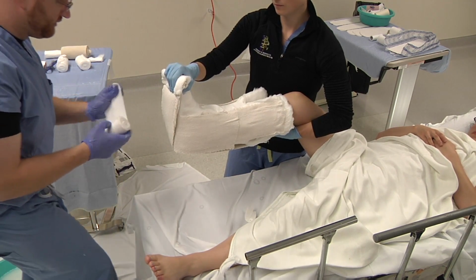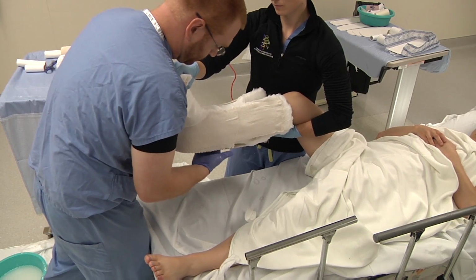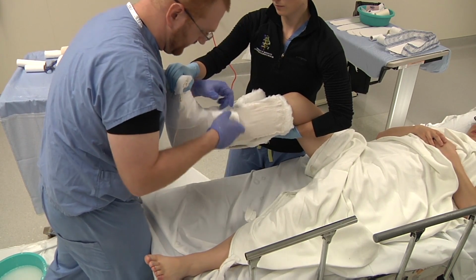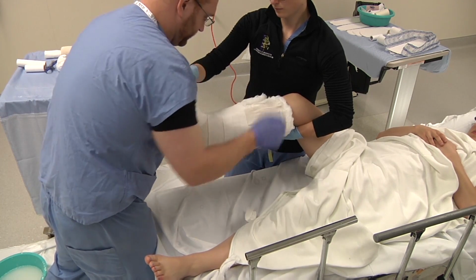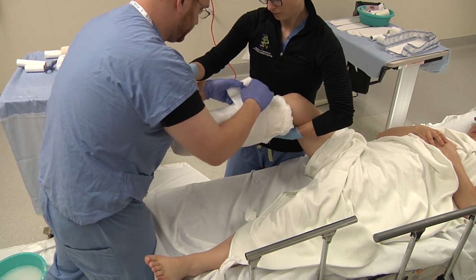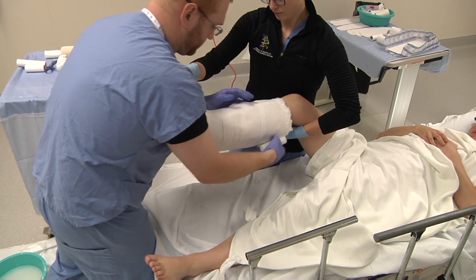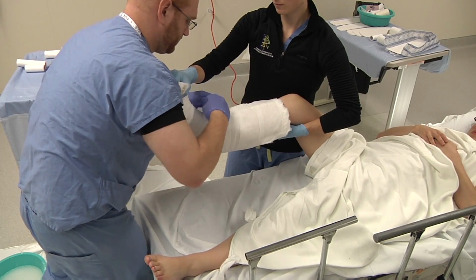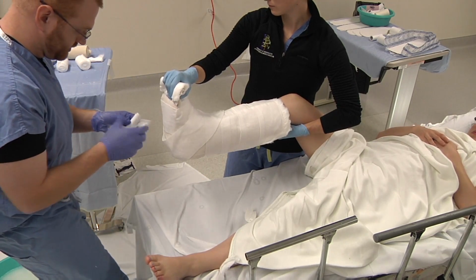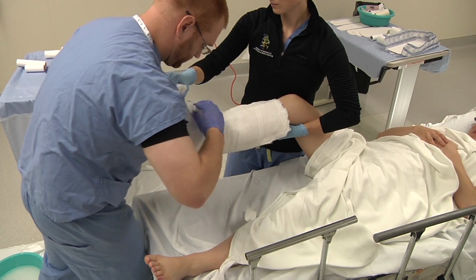It's very helpful at this point to put a roll of cotton over top of your plaster to aid in removal of the splint. Otherwise, it becomes very adherent to the bias overwrap we use and is challenging to take off later. Our cast techs are appreciative when we do this.